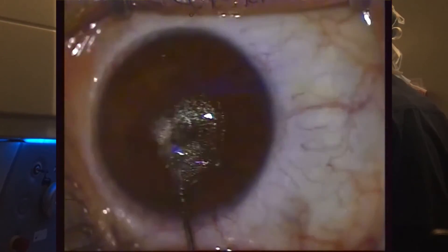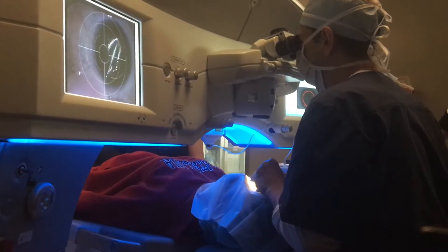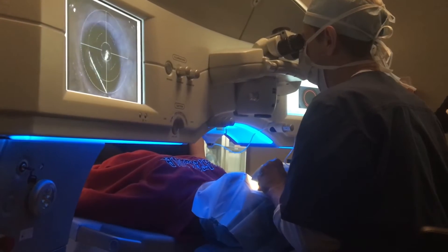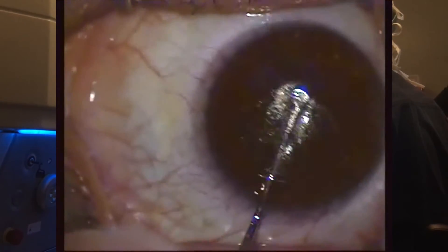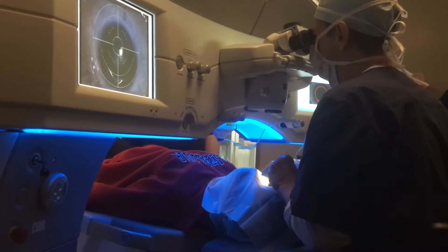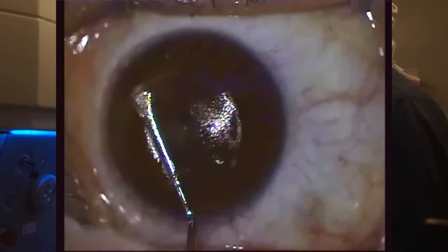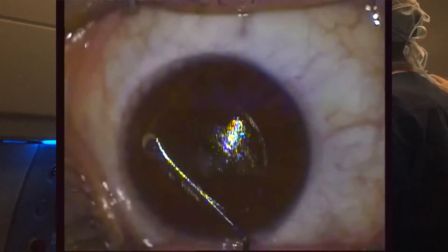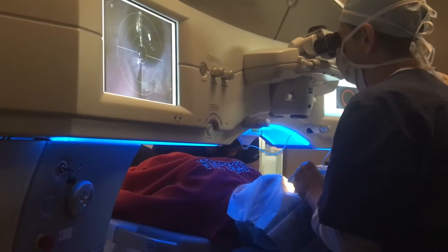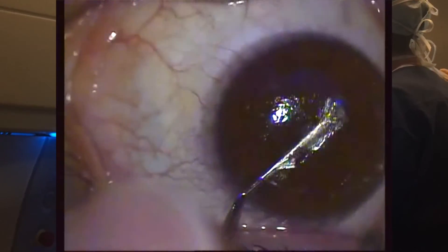First, I am separating the anterior plane starting where I've already defined it and then using a windshield washer type movement in order to complete the separation. We want to be careful not to create any injury to any of the delicate ocular structures, and the patient cannot feel any of this due to the topical anesthesia drops. Here you can see this being completed and then once it is completed, we will then move to the posterior plane.